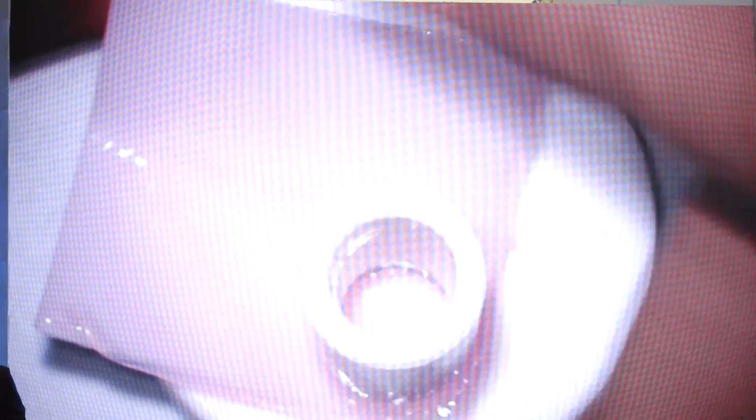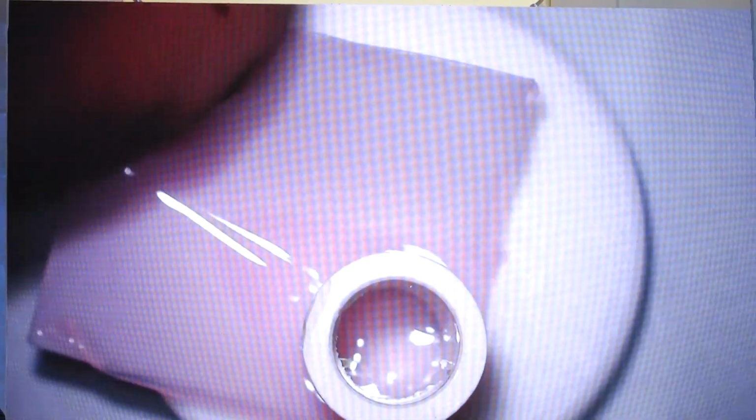Another thing in these cases is that whenever you are applying any form of cyanoacrylate glue, the layer should be as thin as possible. There is no point in giving multiple drops of glue to make a thick plaque sit over the cornea that is more prone to dislodgement when the eyelid movements happen. One thin layer of cyanoacrylate glue is more than enough to seal the perforation if it is within that acceptable range. Here, after removing the chunk of glue, we saw a huge crater sitting below it.